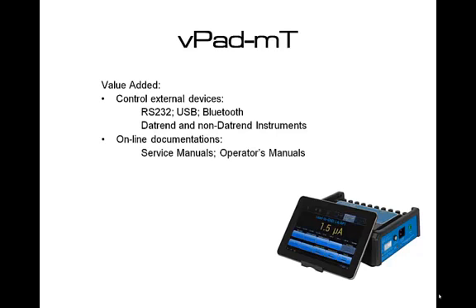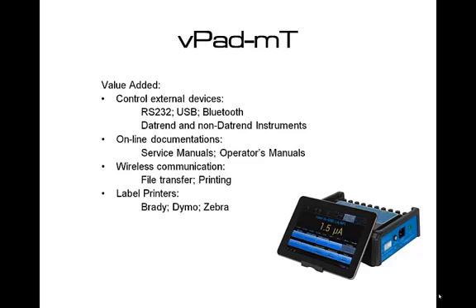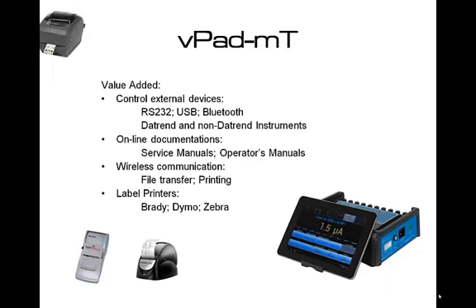vPad provides online access to service manuals, operator manuals, or any other type of PDF document. vPad supports wireless communication, file transfer, and printing. vPad-MT also supports a number of label printers for due date labels: Brady, Dymo, and Zebra.